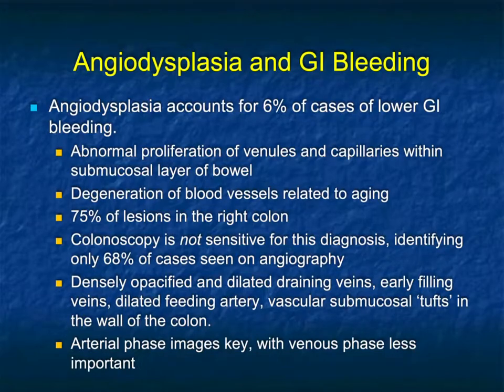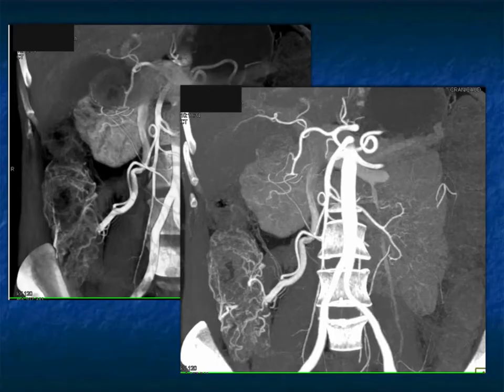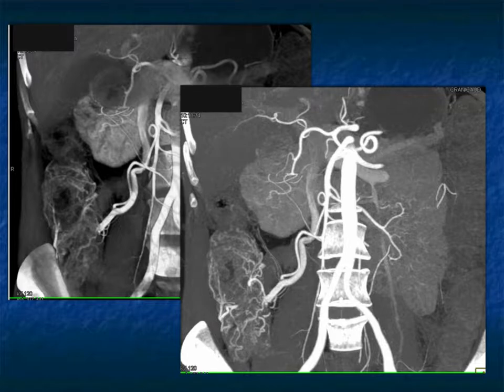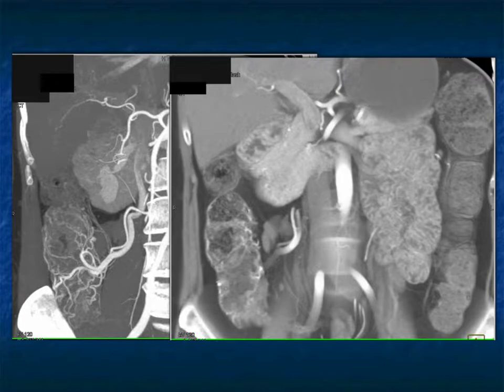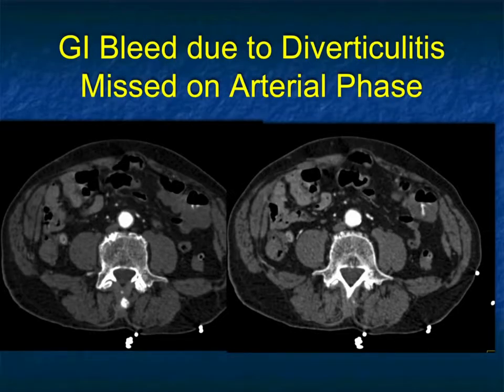Arterial phase imaging is the best phase, but when we do bowel for bleeding we're doing two phases, so we'll have both. Here's a good example of looking at the prominent vessels in the cecum and right colon. This case also makes the point that you really need to go beyond the axials — look on the MIP and volume rendering. Look how nicely that angiodysplasia is seen: the prominent vessels in the bowel, the prominent feeding vessels. Very subtle on the axial, but very obvious on volume-rendered and MIP imaging. Angiodysplasia can occur also in small bowel, but in large bowel it's most commonly in the right colon and cecum.